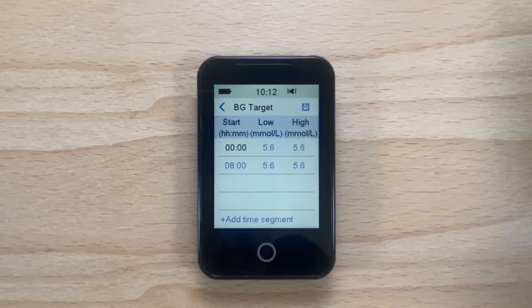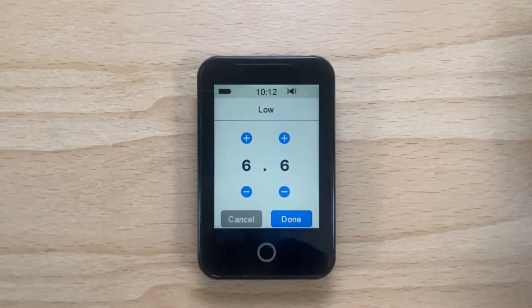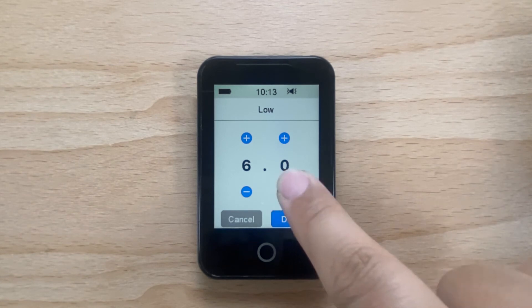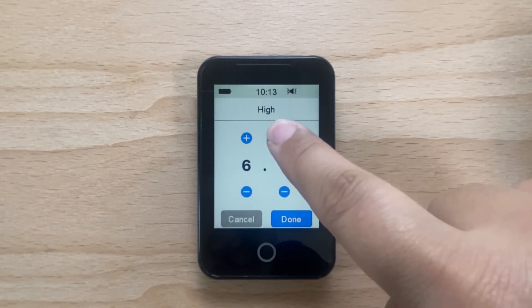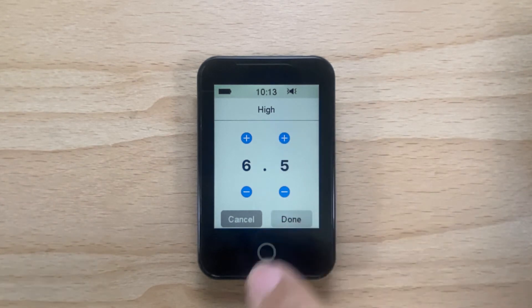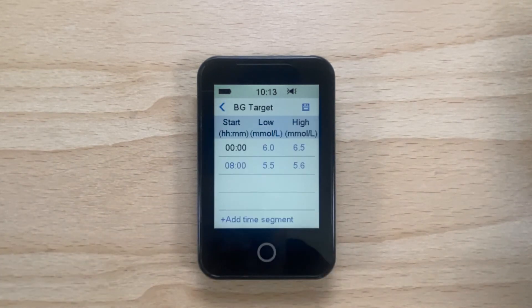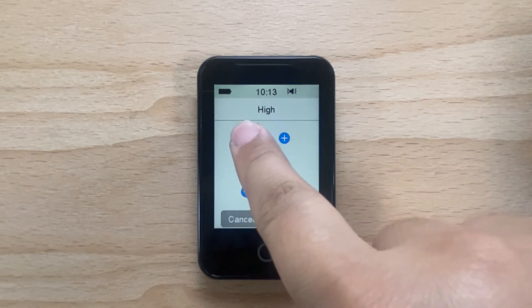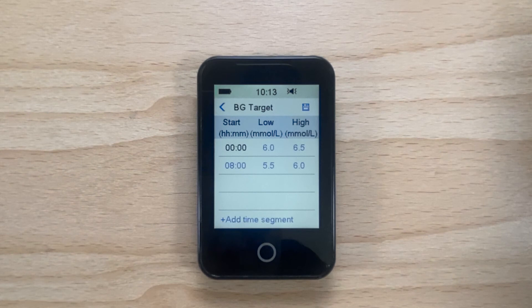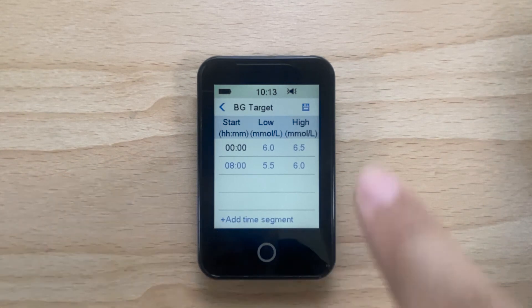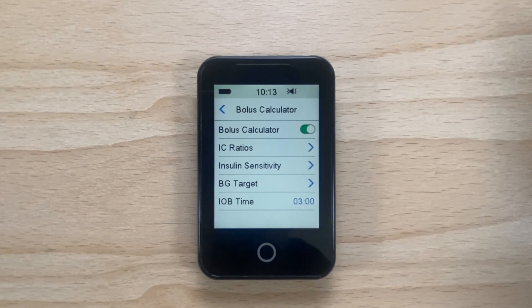You can adjust the blood glucose targets for each time segment by tapping on the blue number next to each time segment. You will notice you can set a low target and a high target. Now tap Done. Once you have completed this, tap the save icon in the top right hand corner of the PDM to save your blood glucose targets.